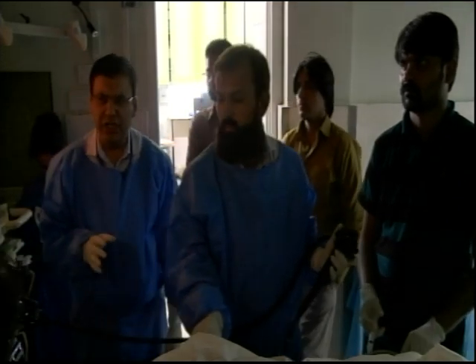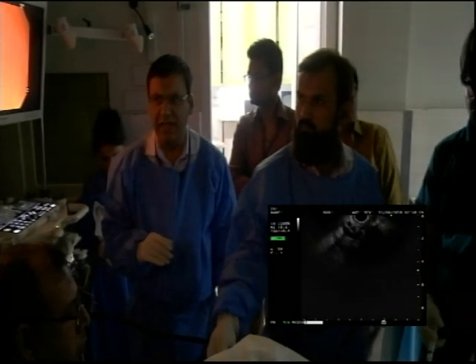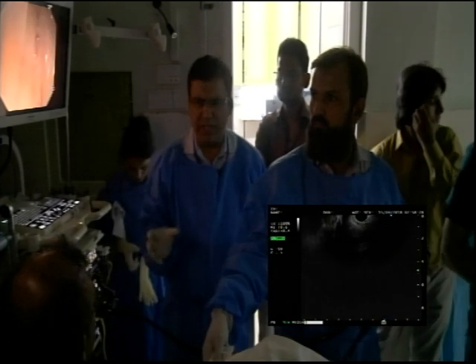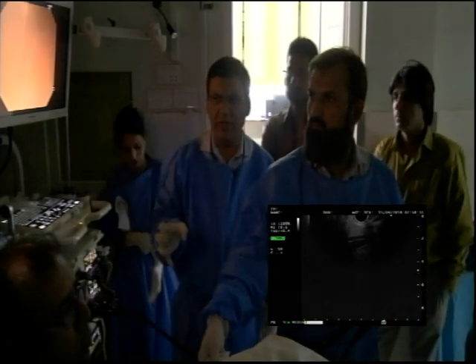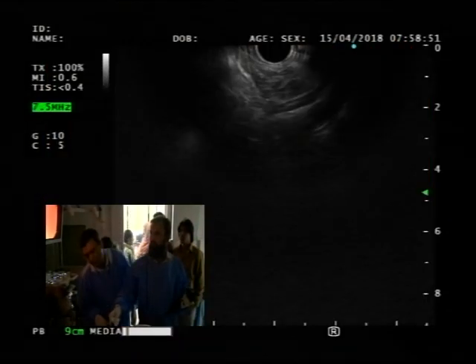Okay. So intubation we have talked about multiple times, just like an ERCP scope. It's a little bit different than an ERCP scope, but the intubation is not much different. Some people like to do it under some view, other people do it with a feel. So it's really a combination of both. Mostly it's a feel because it's a side view camera, and to some extent there has to be some view there as well.